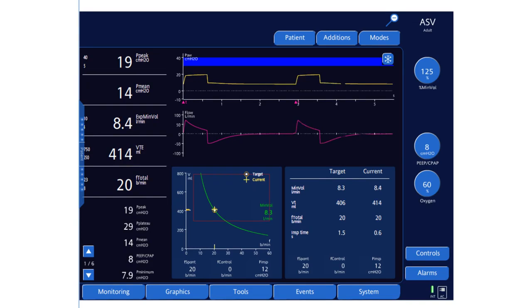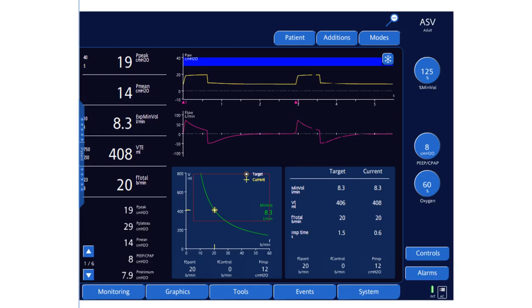The target is 406 ml and we are very close at this point. The pressure has settled at 12 cmH₂O, and we're achieving the target. The current minute volume is 8.3 liters per minute — the machine is giving no mandatory breaths at all — and the patient is breathing spontaneously at 20 breaths per minute.